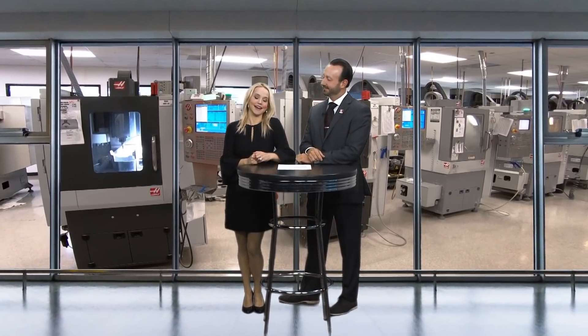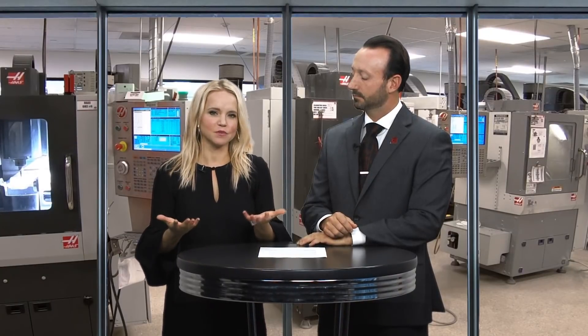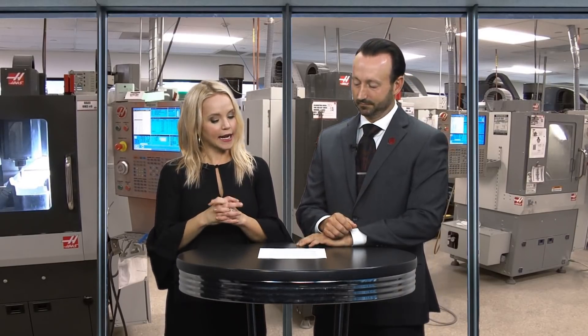Hello and welcome to Chairside Live. I'm Megan Strong and I'm Will Schmidt, Registered Dental Assistant here at Glidewell Dental. On today's episode we've got part one of a three-part series from Dr. Chi, and he's using the latest in material science: Bruxer Aesthetic. He's replacing some PFMs on number 7 and number 10, and these can be challenging cases. What are some of the problems that clinicians might face in a situation like this?